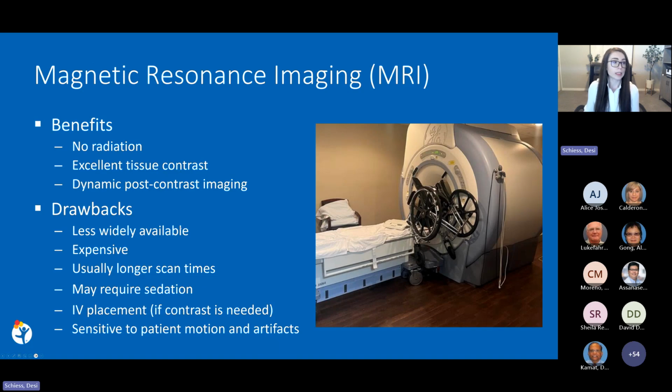Moving on to MRI, these scanners generate images through a powerful magnetic field, which also poses safety risks as seen here, where projectile objects can become pinned to the scanner. MRI is particularly valuable in children for whom minimizing radiation exposure is critical.